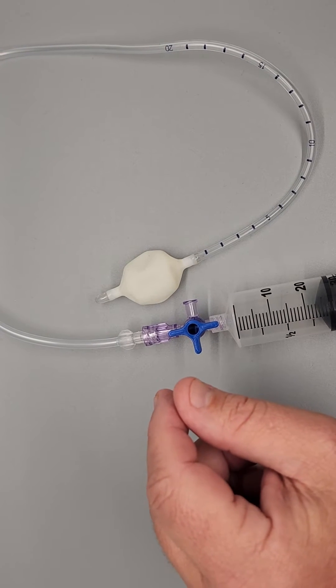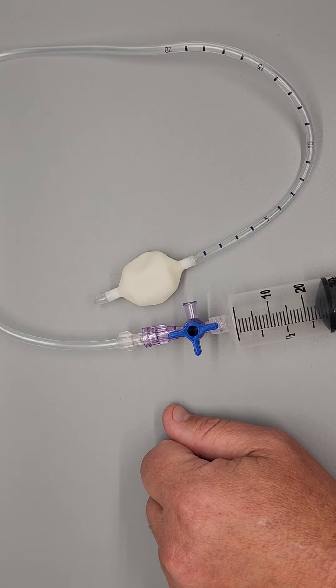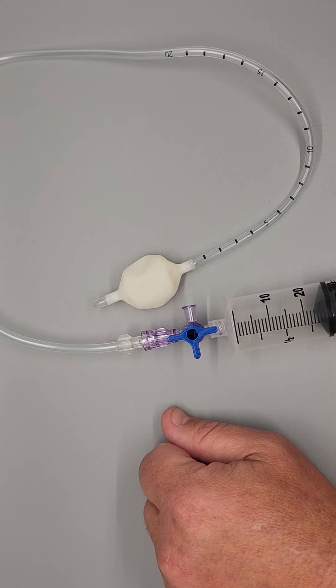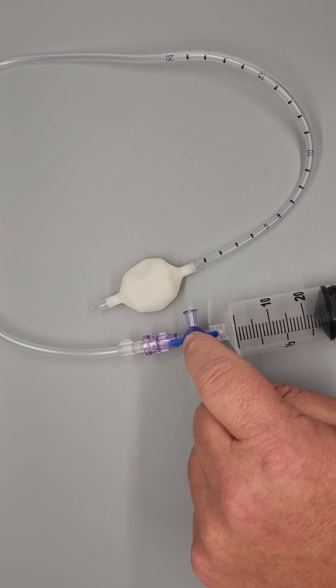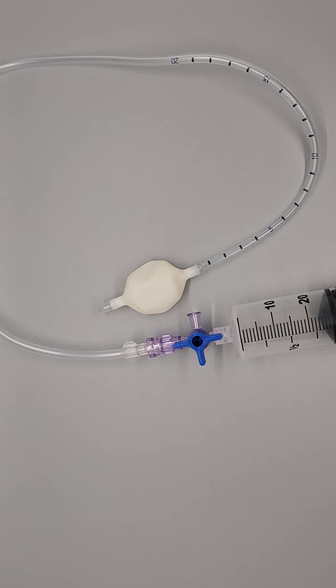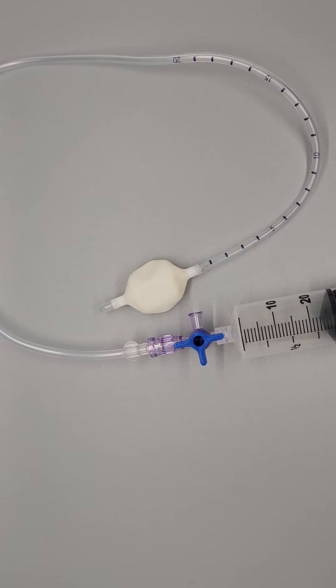Hello. With all the supply chain issues that we've had over the last year, one of the items that we've changed is the stopcocks that we use with the balloon catheters. And since we've made the change, we've had some calls asking how to use the stopcocks for the catheters.